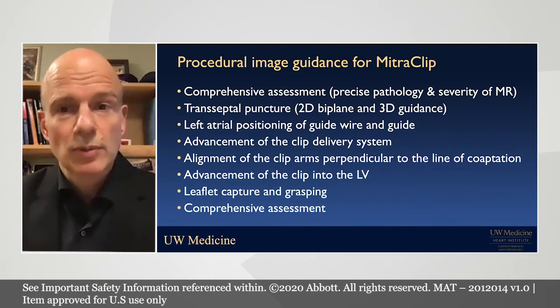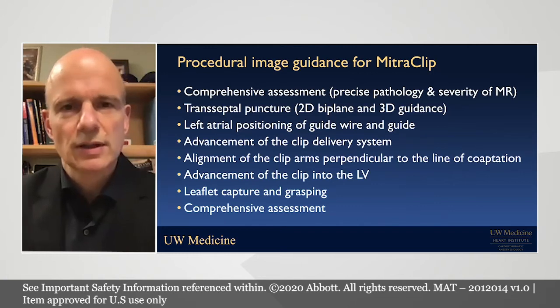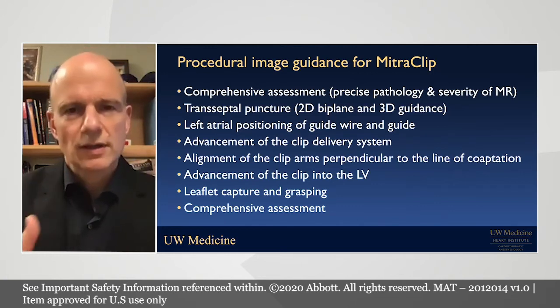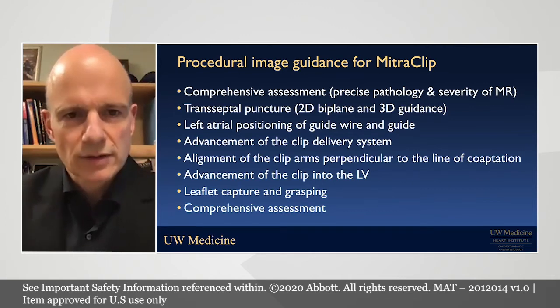And I'm using biplane and 3D guidance for that. Then obviously it's about guiding the guide delivery system and the clip coming into the left atrium, advancing the whole system into the left atrium and ultimately into the left ventricle.